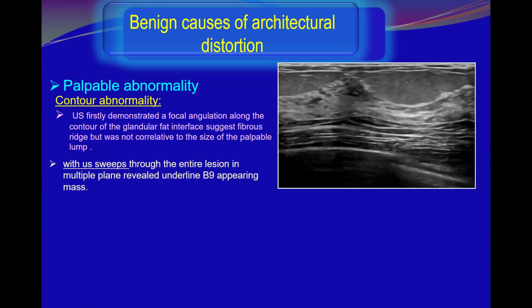But we have to consider the clinical picture. And as I mentioned in the lectures on technique, you have to put your finger below the transducer to make sure you are in the same place. You have to ask the patient to point with her finger where exactly. And you have to correlate the size and shape under your finger and correlate it to the ultrasound image.